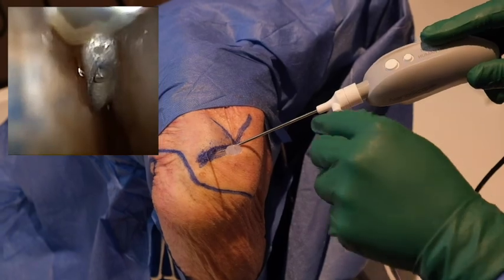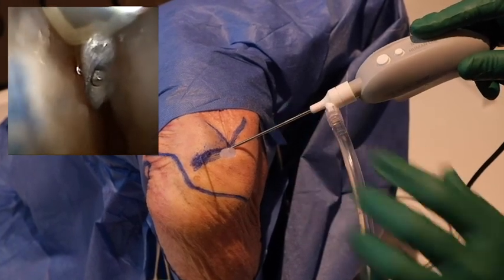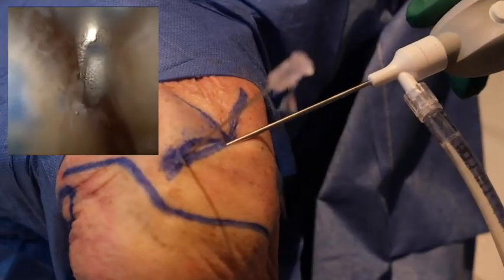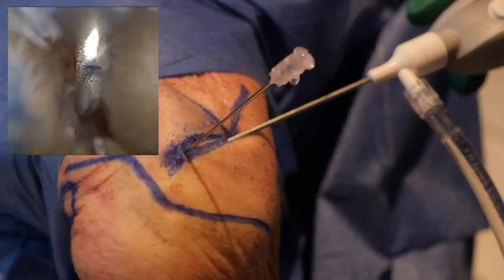Once the skin and capsule are penetrated, saline tubing can be connected to the arthroscope sheath. The joint is rapidly filled with fluid and leaking can be seen exiting from the spinal needle.